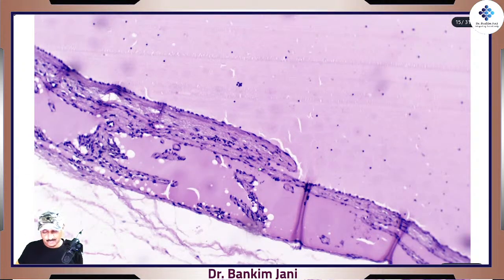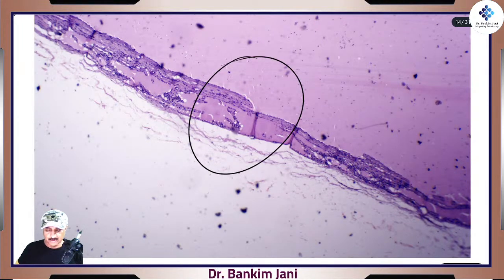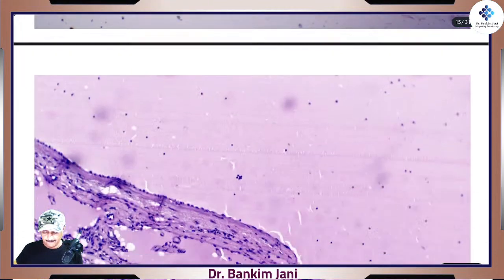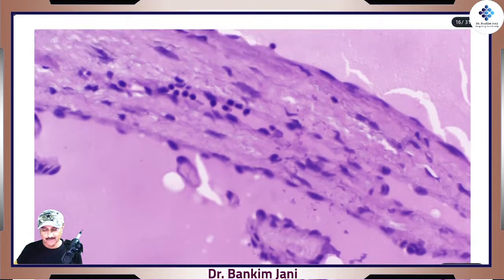Let's zoom. See, it is this part which we are focusing on. This part. So we zoom, you can see this projection, this one. And if we zoom further, now this is so wonderful.